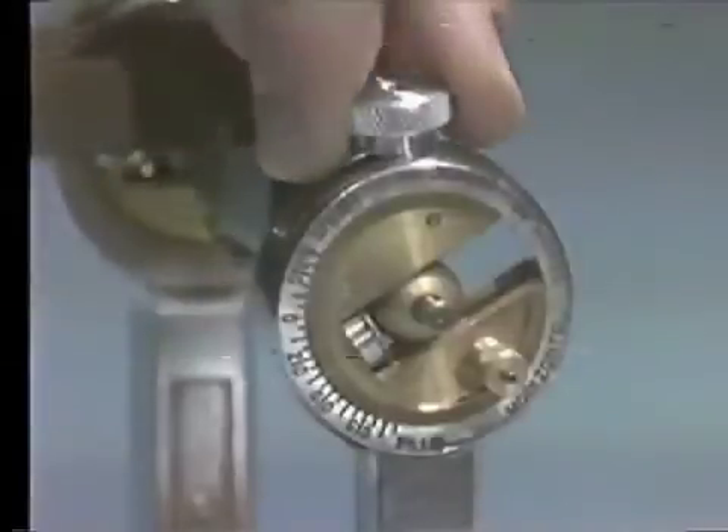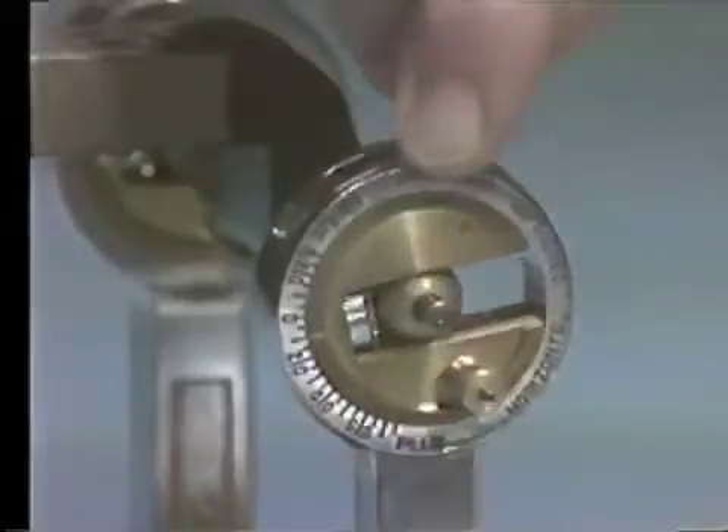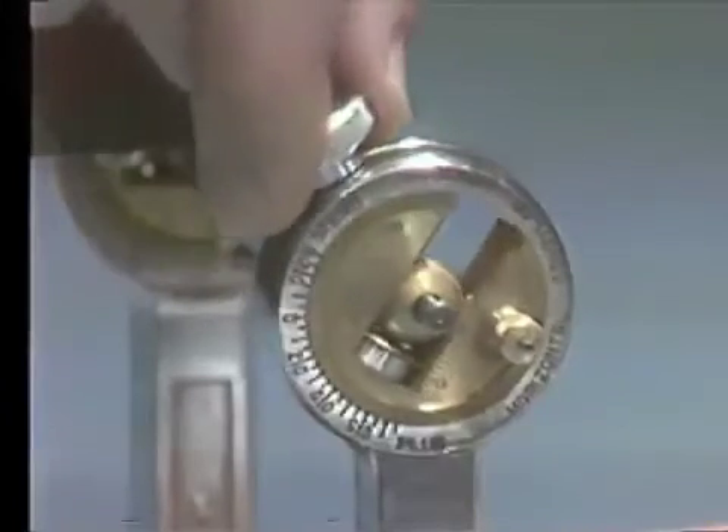The first adjustment is to unlock the thumb nut on the condylar guidance. Rotate the condylar guidance back and forth from zero to 70 degrees to see if it moves freely. Set the scribe line on zero and lock the thumb nut.